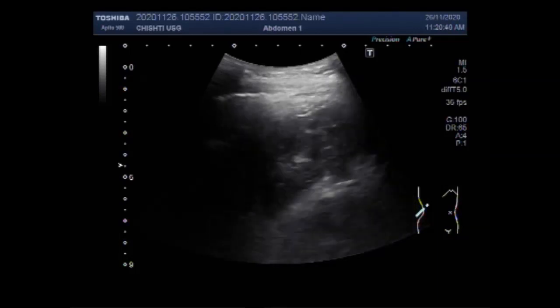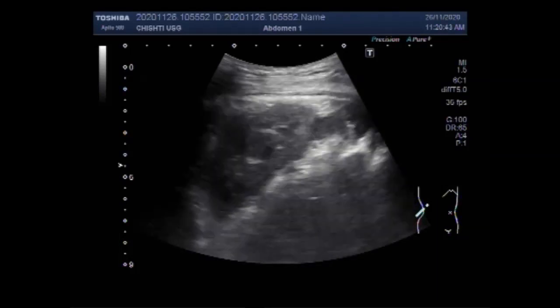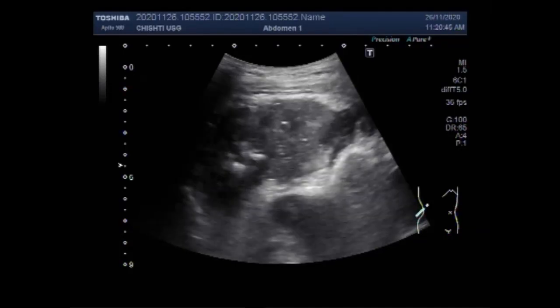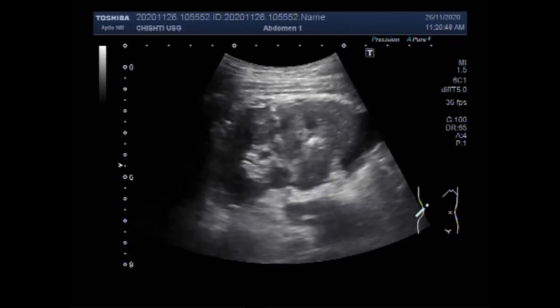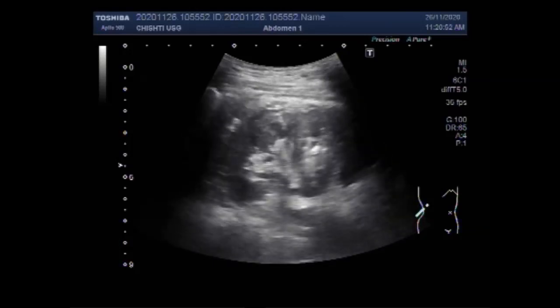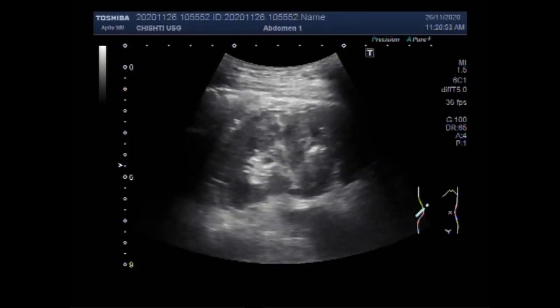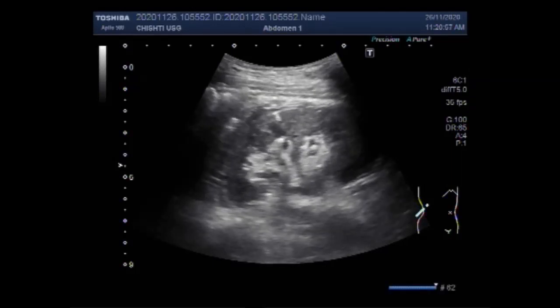The perinephric space is the largest of the three divisions of the retroperitoneum and is the most easily identified. It contains the kidneys, renal vessels, proximal collecting system, adrenal glands, and an adequate amount of fat to allow identification on CT imaging.